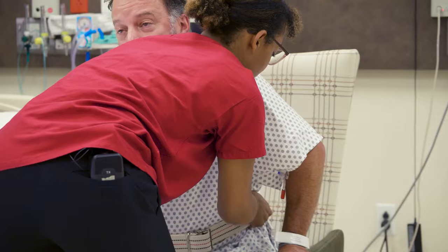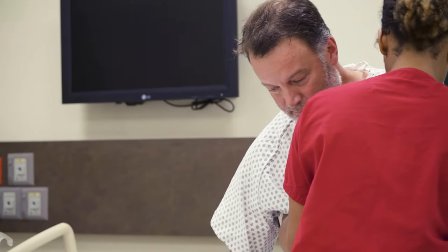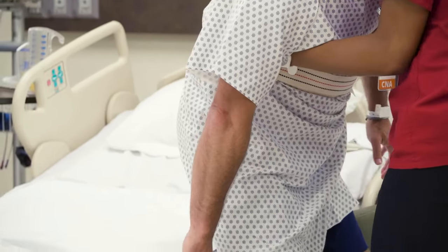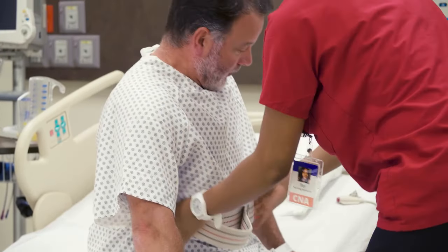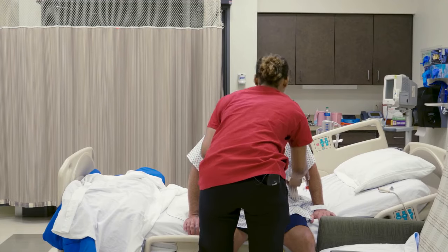Grasp the belt from underneath with both hands, and after ambulating or transferring the person, carefully remove the belt and assist the person into a comfortable and safe position. Okay, let's remove this. Let's get you into bed nice and comfortable.